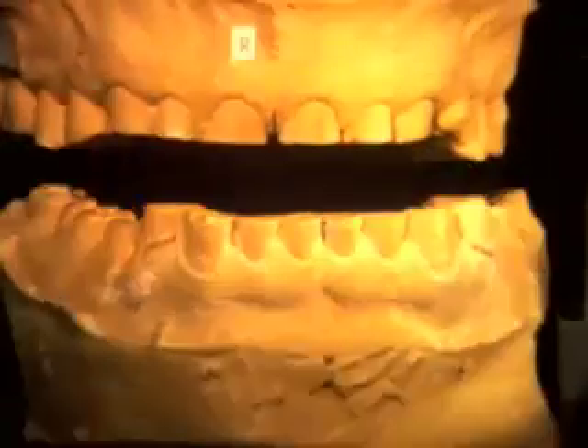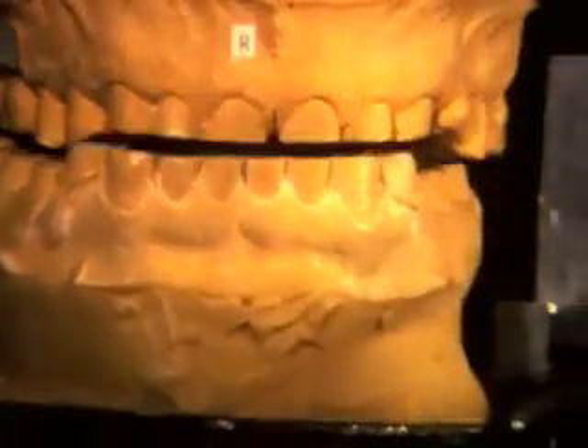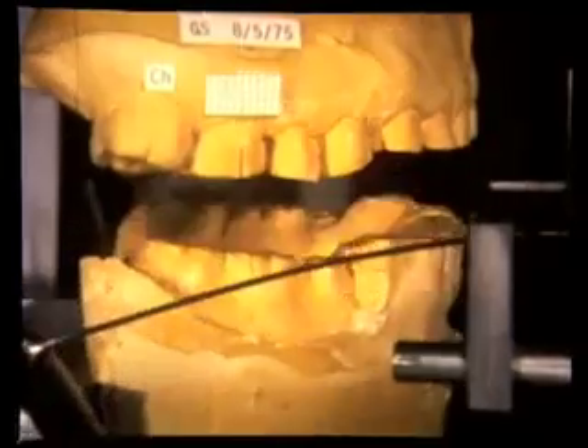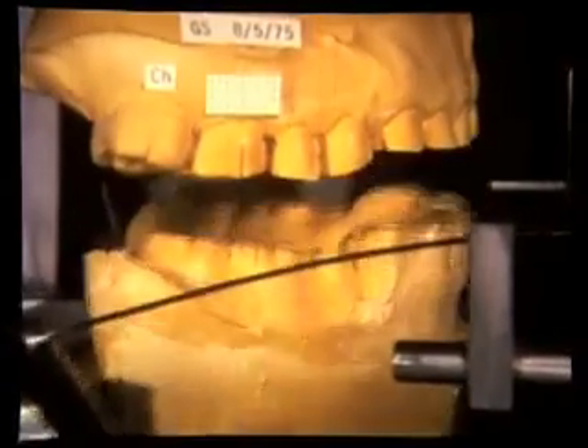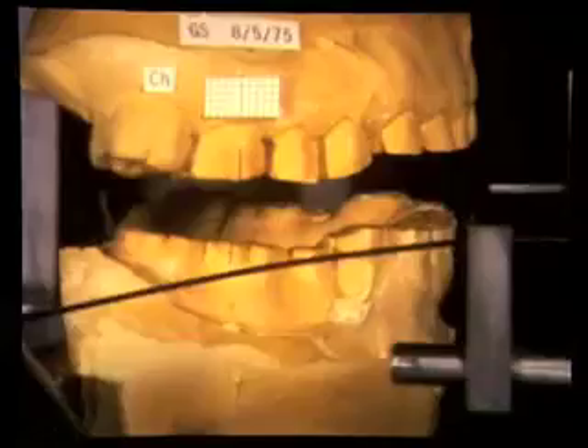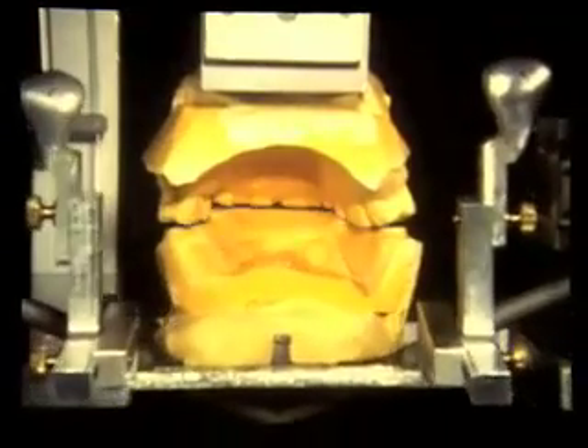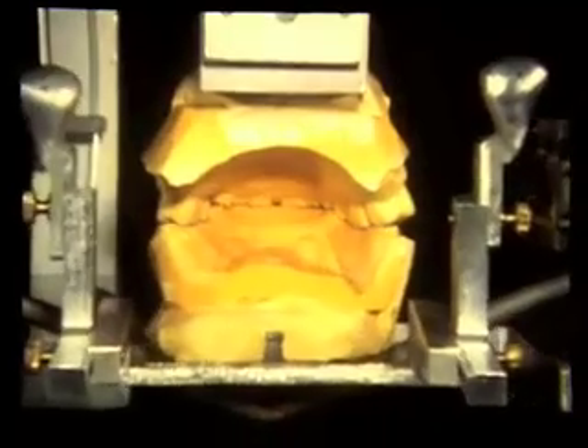Our bruxer with severely worn teeth was used for a number of different displays of total jaw movement. Included was the opportunity to study lateral joint stability, or Bennett movement. Some dentists have doubted that Bennett movement exists, especially during chewing, while others have strived to precisely record and reproduce it in an articulator.